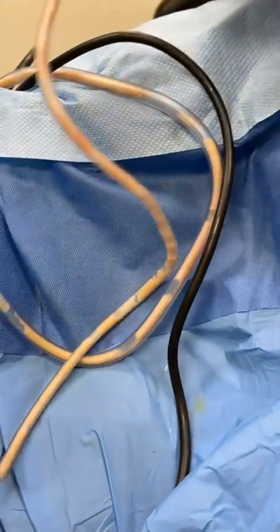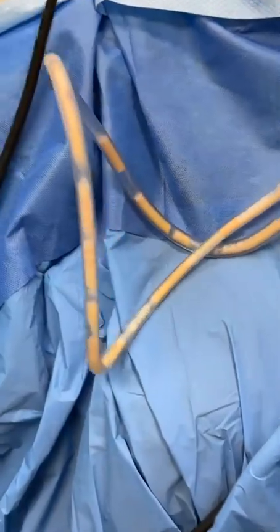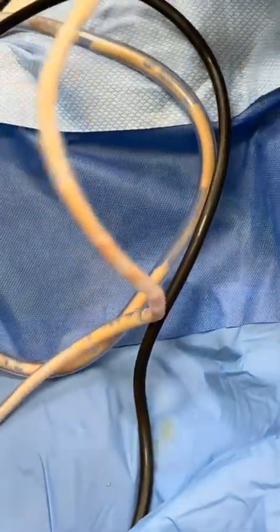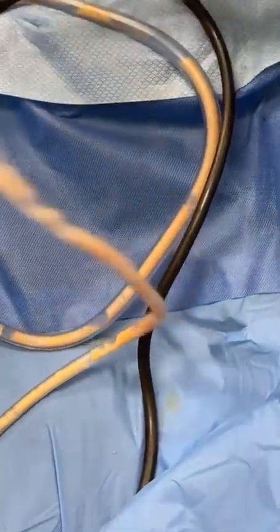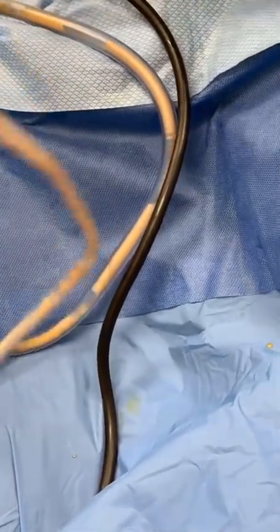See, even in patients like this that we're not doing a fat transfer on, we want to keep the blood loss to near zero, basically. That way they recover faster, they have more energy, they're going to walk more. In addition to that, the anesthesia that we give is going to last for 2 days, so they're going to prevent a blood clot.